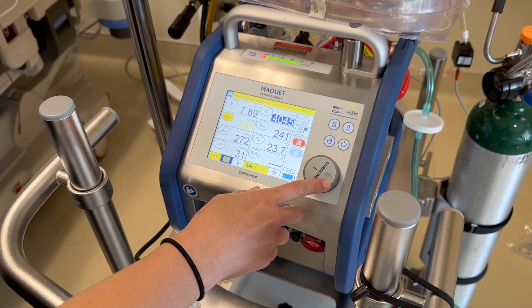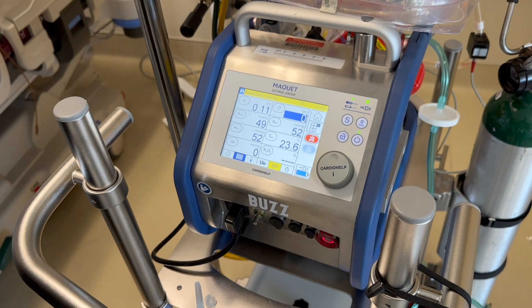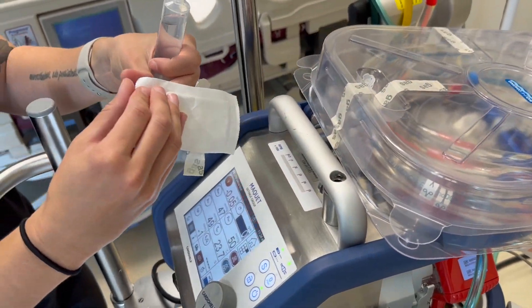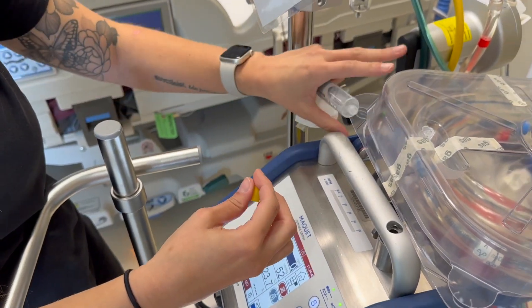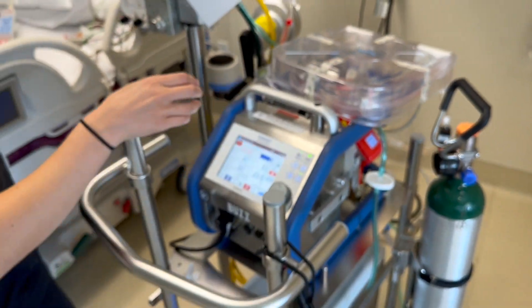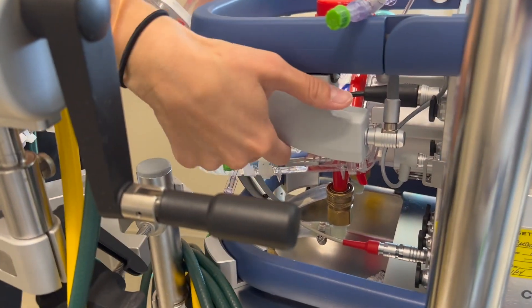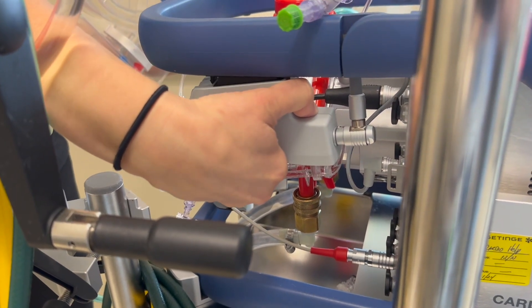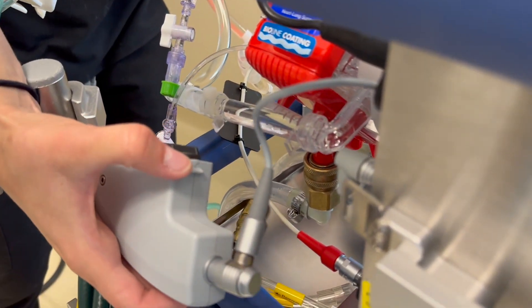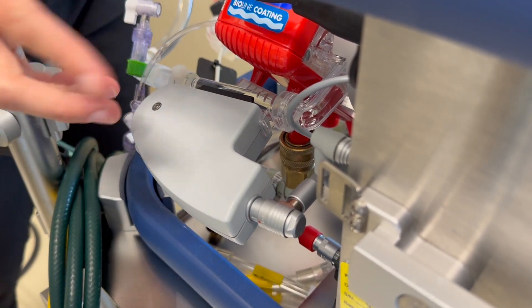Now put the de-airing cap on your oxygenator, which is located right here. Open it up — it goes right next to the pigtail. Then take the venous probe from your safety guard and place it on your oxygenator. Push the button on the side and rock the venous probe off the safety guard. Place it on your oxygenator — it can only go one way, with a little tab and a hole — and you'll hear it click on.